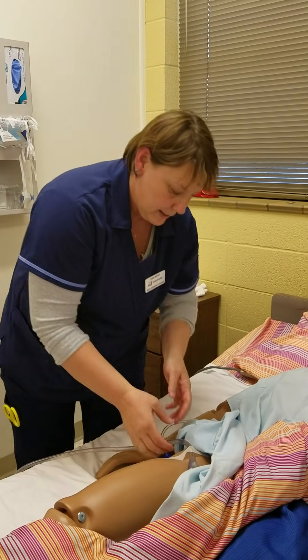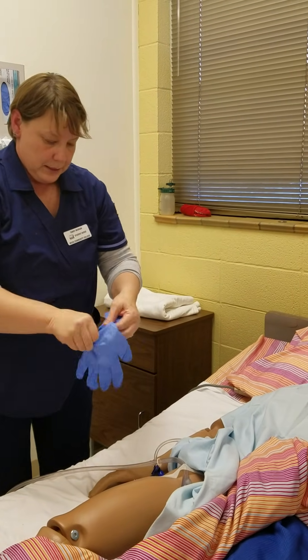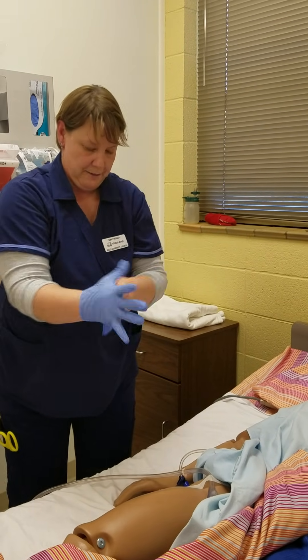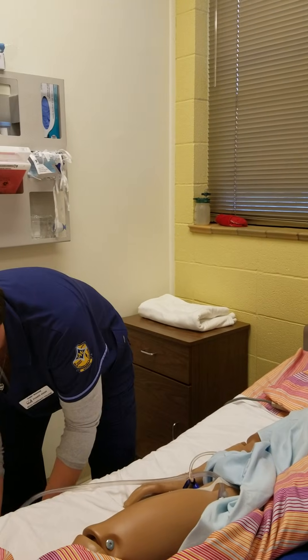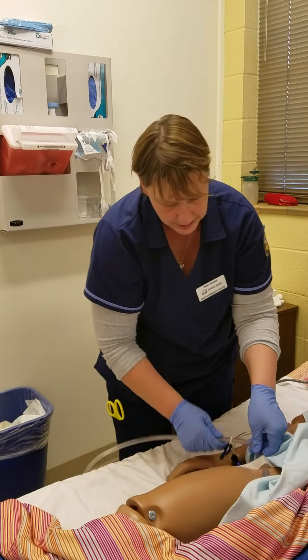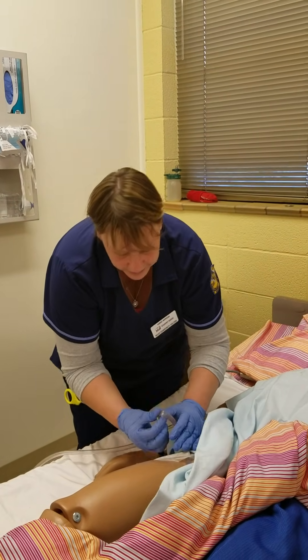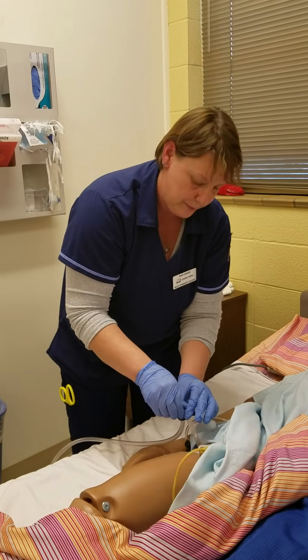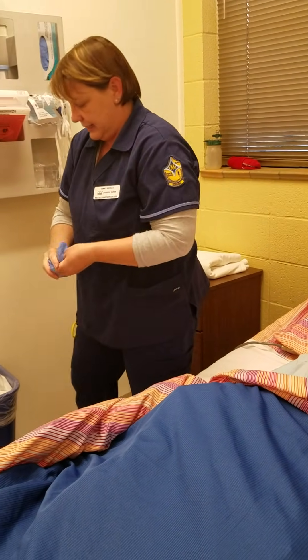I see that there's quite a bit of urine in this tube, so there's old urine in there. I'm going to put on my gloves and drain the urine out of the tube back down into the collection bag, going from bottom to top so that it doesn't flow back in. Once I have the urine drained out of the tube, I'm going to pinch the tube off and clamp it there. Jose, that will take about five minutes, so I'm going to step out and I'll be back.